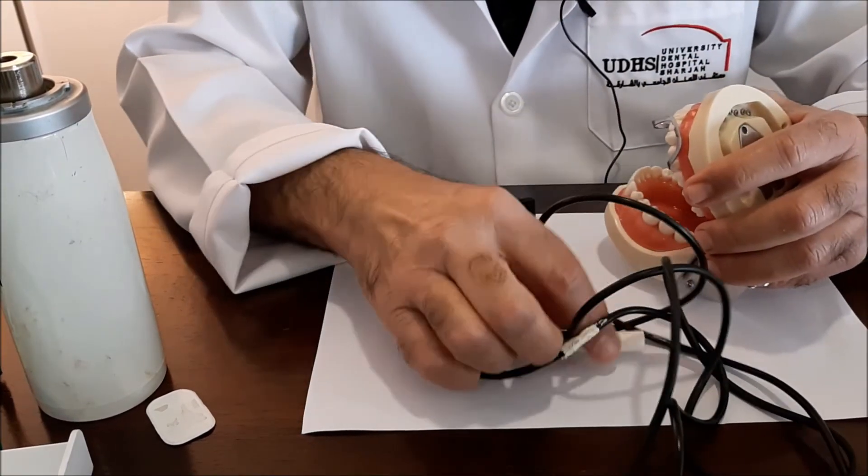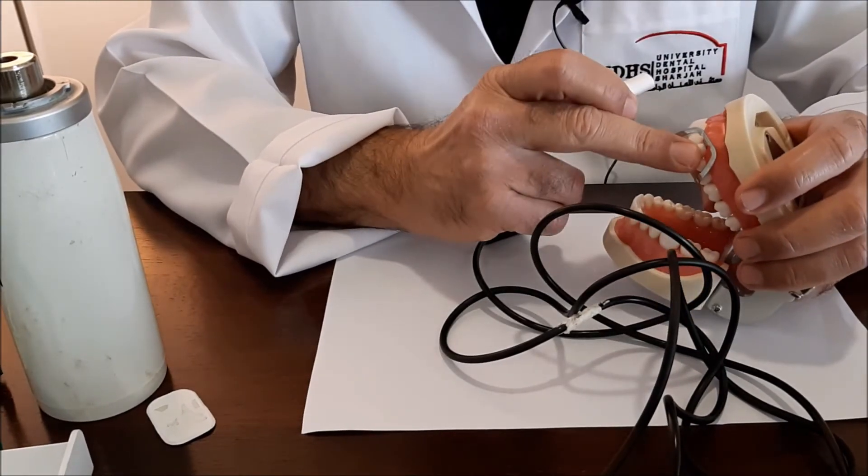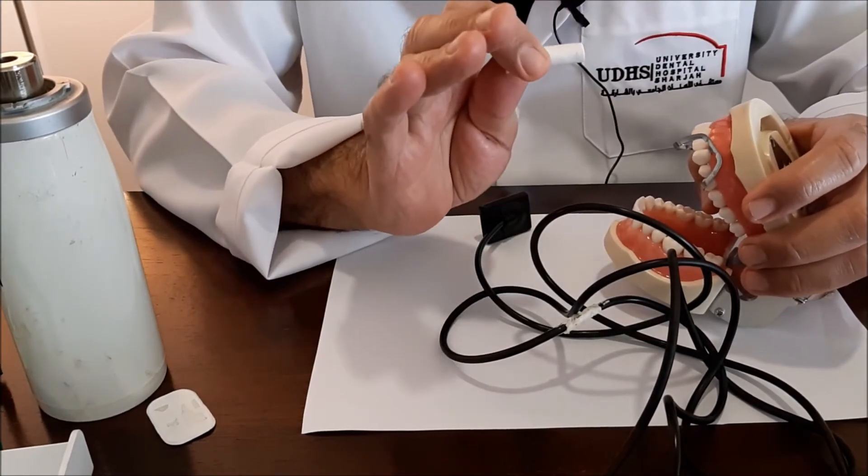So the cotton roll, I again advocate its use whether on the central incisors or the canine or any other area of the mouth.